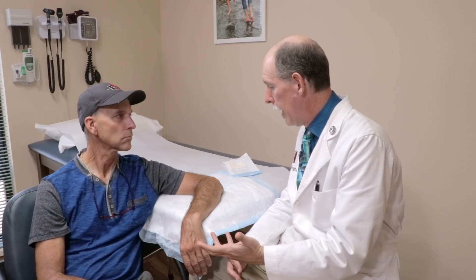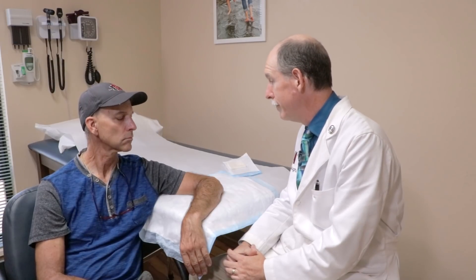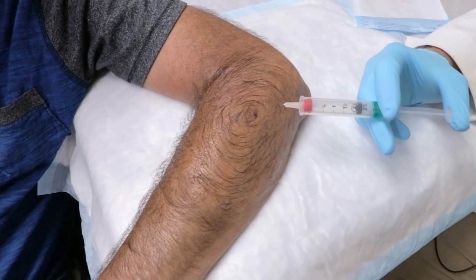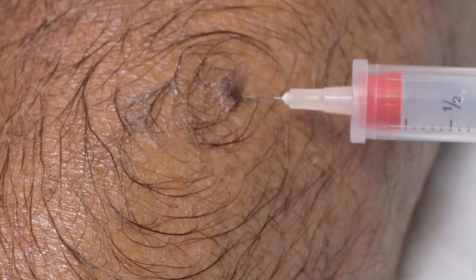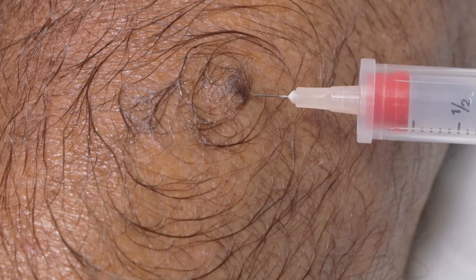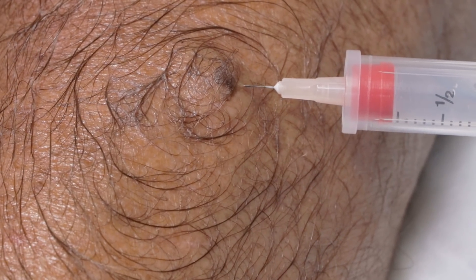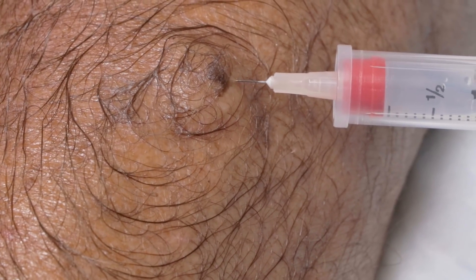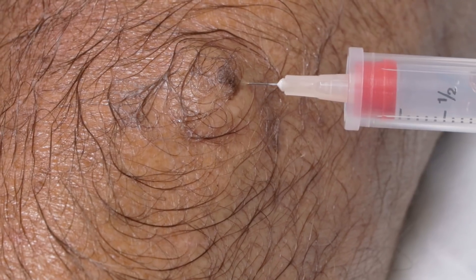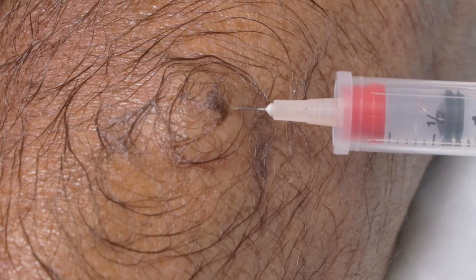And if it did turn out to be a cancer, depending on what type, we'd have to get it addressed either here in the office or by a dermatologist. So I'll be giving you a shot here with lidocaine with epinephrine. I'm told it's actually hard to find in our area right now. I was told to be real conservative with it, but I don't want you bleeding all over the place, especially with a punch biopsy. With a shave it might be different — you might be able to go without the lidocaine with epinephrine, just use lidocaine.